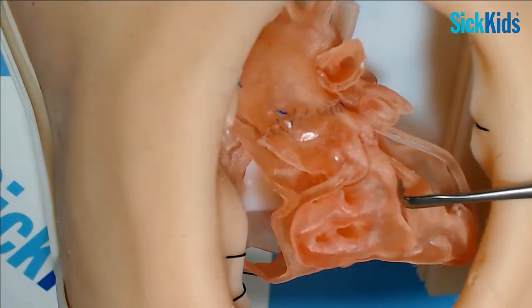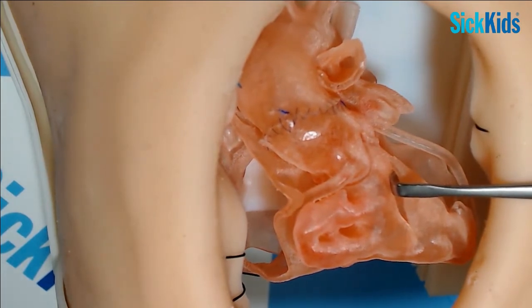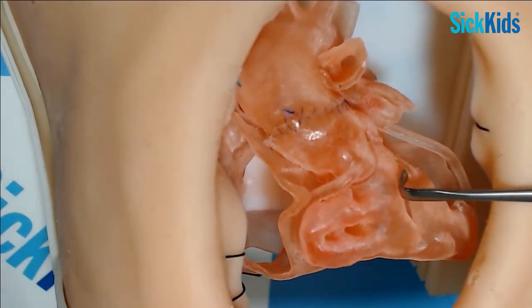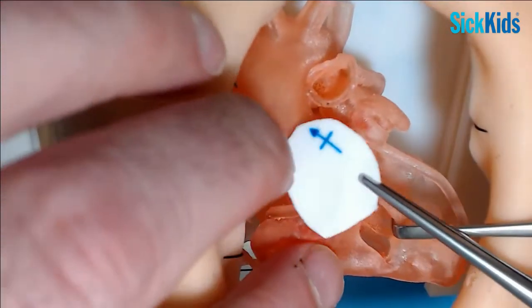Okay. So you then want to cut your patch. You often tend to make it a little bit bigger than you think you need to at first. And it needs to have width as well as length, yeah? I hope that's about right. I've got a pair of forceps in there. So if you look inside there, that's probably going to be about the right size.